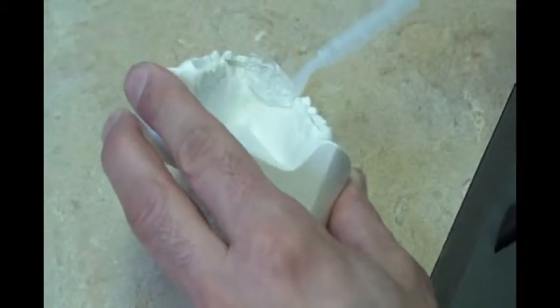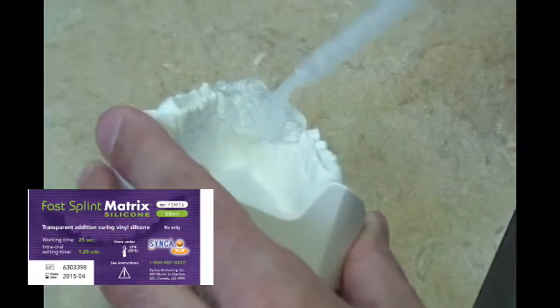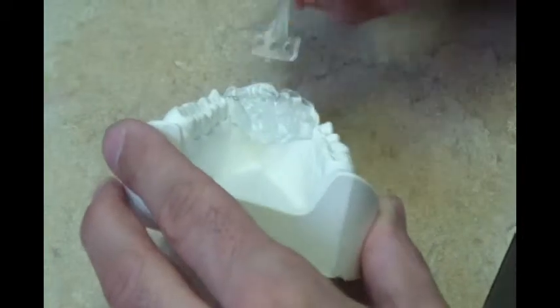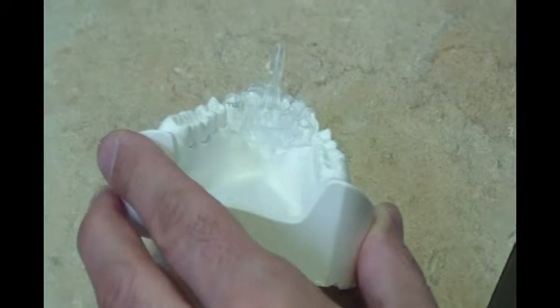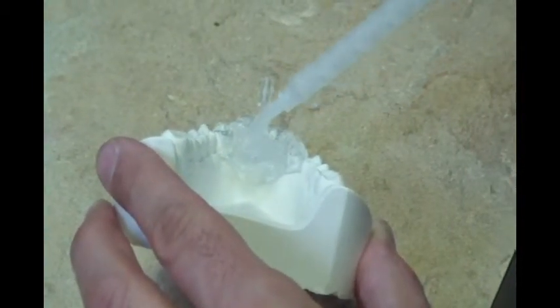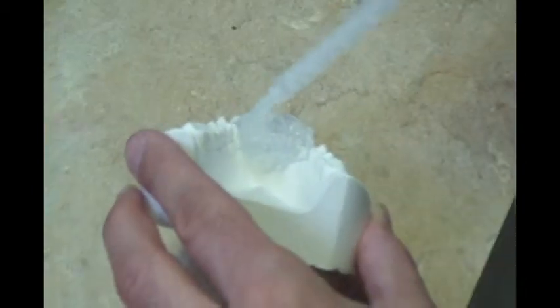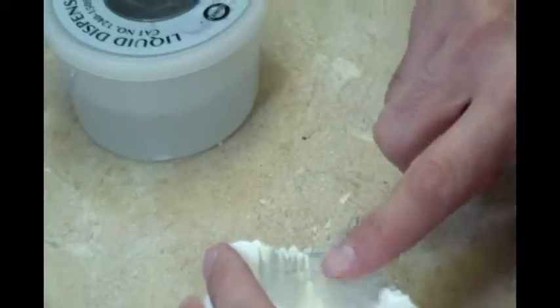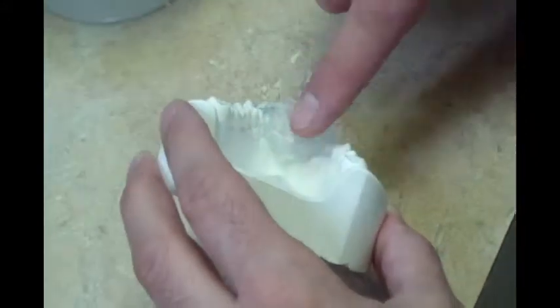Using the wide tip, inject the matrix clear silicone over the lingual and incisal surfaces of the teeth to be retained. Once an initial layer of silicone has been applied, insert the matrix T-tip onto the lingual surface and continue to cover the area with an additional layer of silicone. Using a finger wetted with alcohol or any other separating media, gently mold and shape the silicone to create a relatively smooth surface. Allow to cure for approximately one and a half minutes.